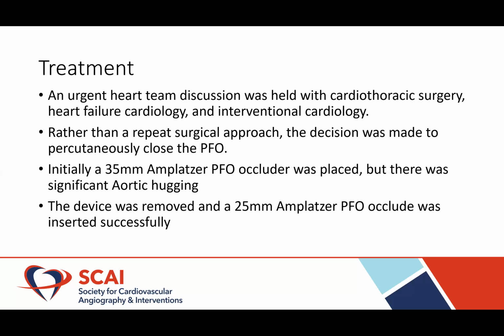So there was an urgent heart team discussion that was held with cardiothoracic surgery, the heart failure team that has been taking care of the patient longitudinally, in addition to our interventional team. Rather than reopening the patient's chest after his recent surgery, the decision was made to percutaneously close the PFO.